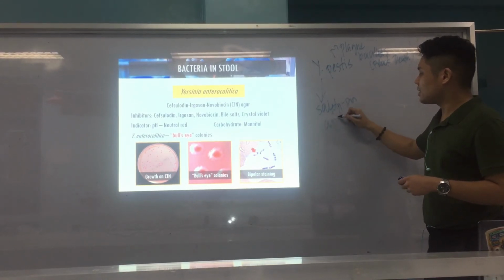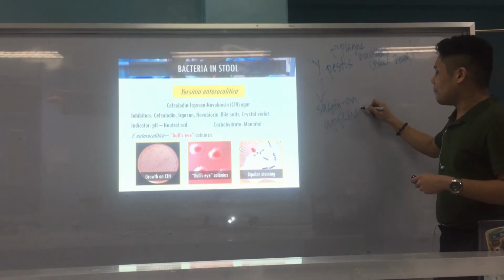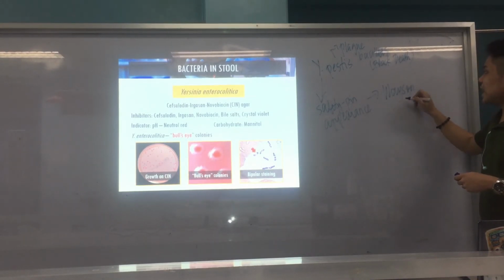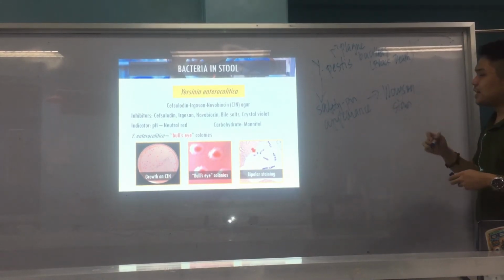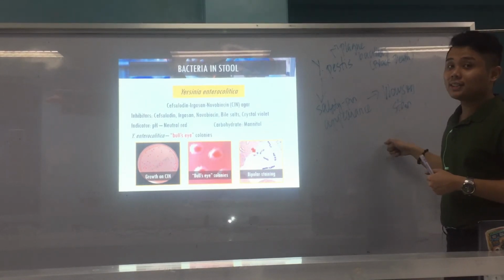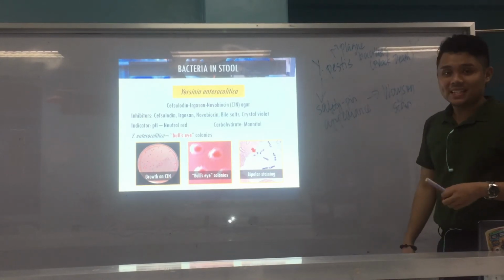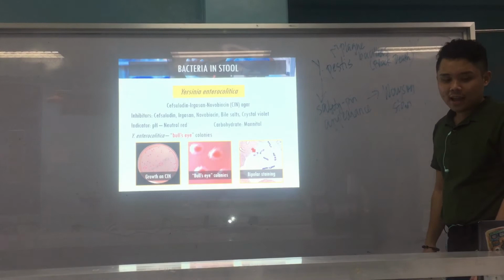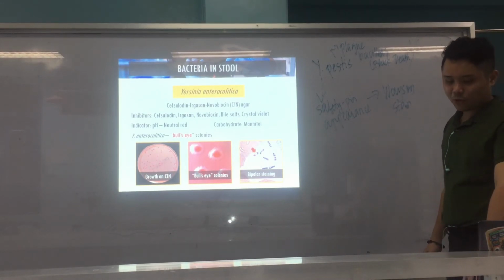The appearance is similar to Yersinia enterocolitica, but this one is seen under Wayson stain. It is a different stain. Safety pin appearance. Wayson stain. Yersinia pestis, again, is your plague bacillus, the causative agent of the black death or black plague. Alright, that's for Yersinia.